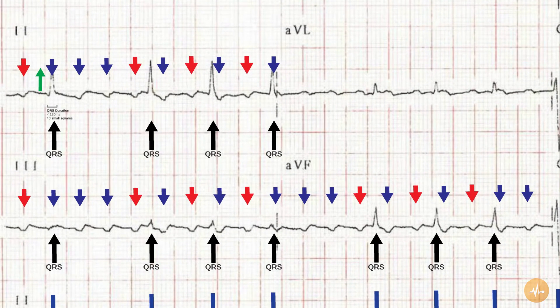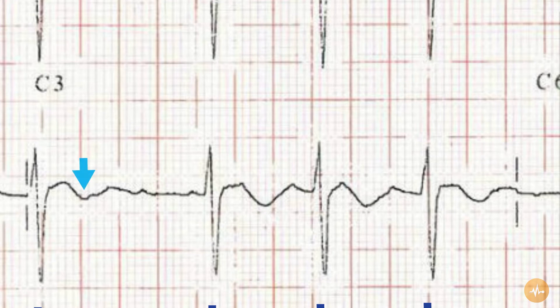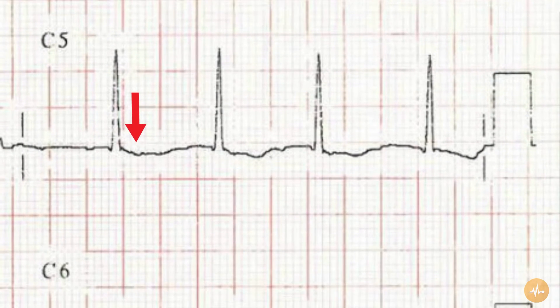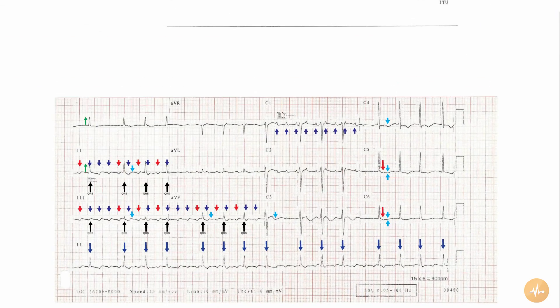The T wave morphology is slightly disturbed by being superimposed upon the flutter waves, but the T waves appear to be inverted in all 3 inferior leads 2, 3 and AVF. They are also inverted in leads V3 and V4 and flat in lead V5 and V6.